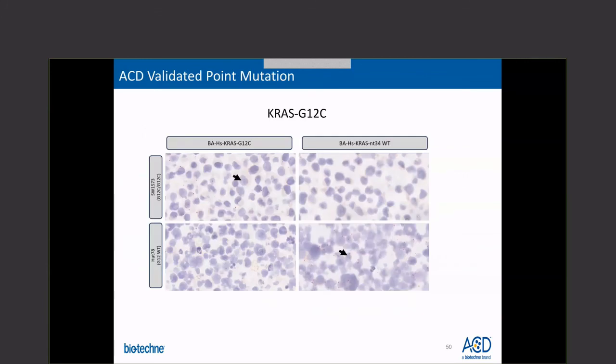Another application area is the visualization of point mutation. BaseScope assay can detect transcripts down to a single nucleotide change. For example, KRAS G12C mutation is observed in several malignancies, predominantly in lung tumors and colorectal cancer. It is a driver mutation which promotes tumor growth and results in resistance to standard therapies. Using 1ZZ point mutation probes targeting either the KRAS G12C mutated sequence or KRAS G12 wild-type sequence, it was possible to visualize the positive signal in cells homozygous for the KRAS G12C mutation.